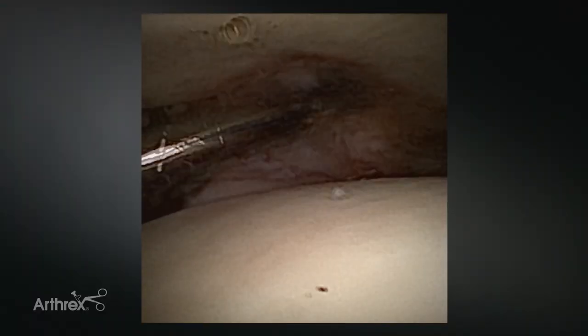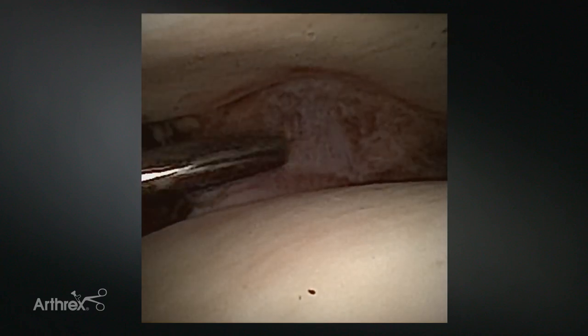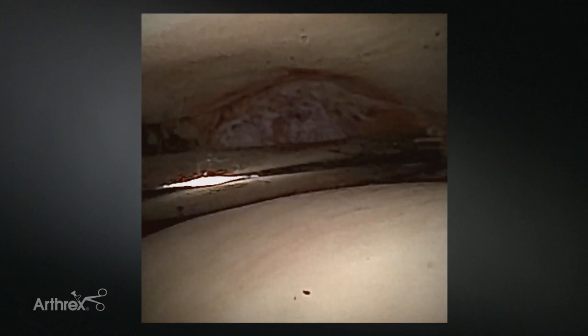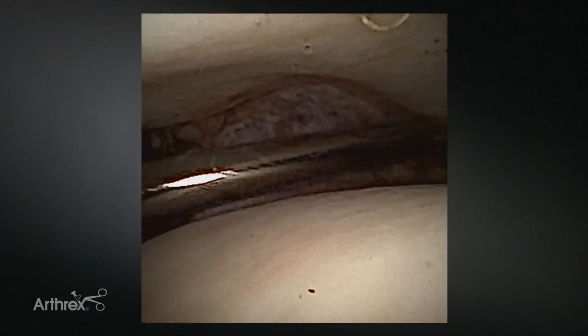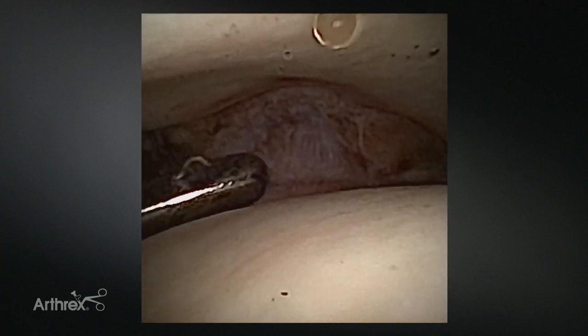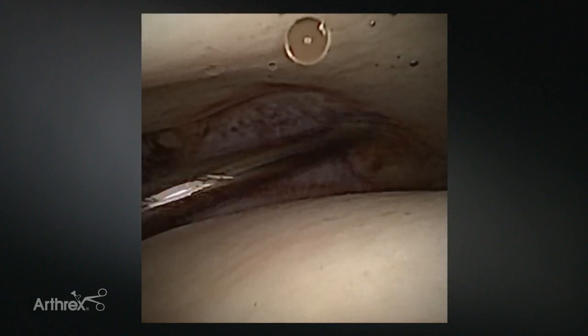Using the Sabre shaver allows you to get in here into the small joint. In this case, we have redundant tissue in the syndesmosis, and I also use this to evaluate my syndesmosis — 10 to 15 percent of ankle instability will have a component of syndesmosis instability. Using nano, I'm able to evaluate the syndesmosis intraoperatively, not only with a dynamic examination but also direct visualization. There is plenty of literature showing that direct visualization is much better than even preoperative fluoroscopic examination.